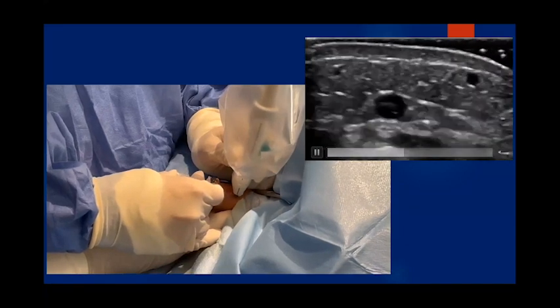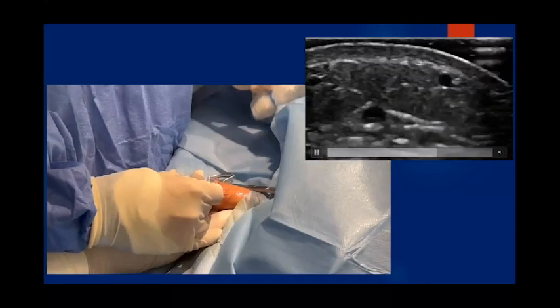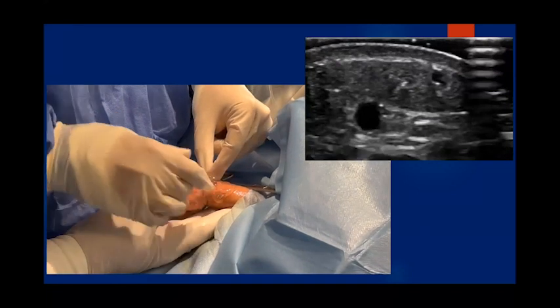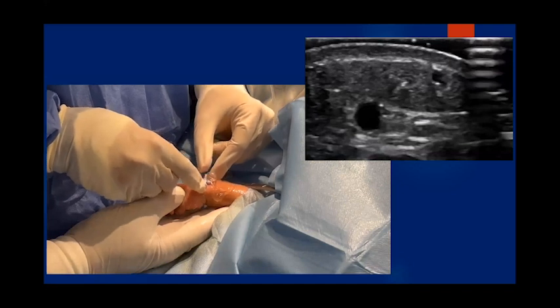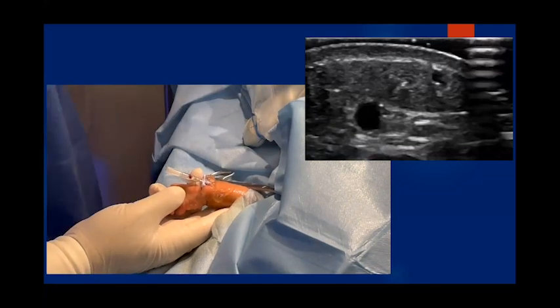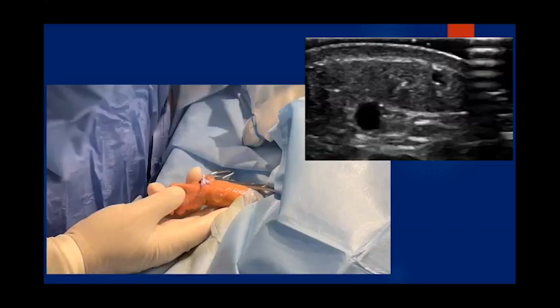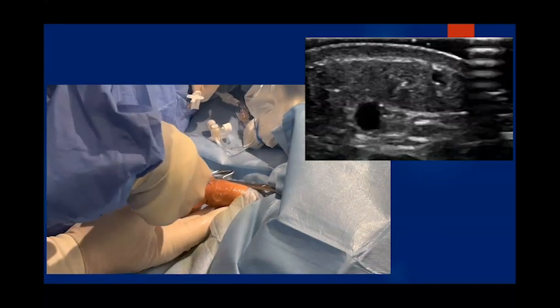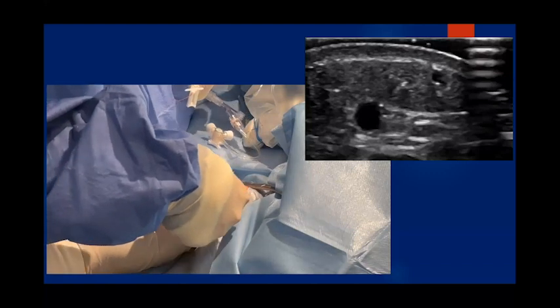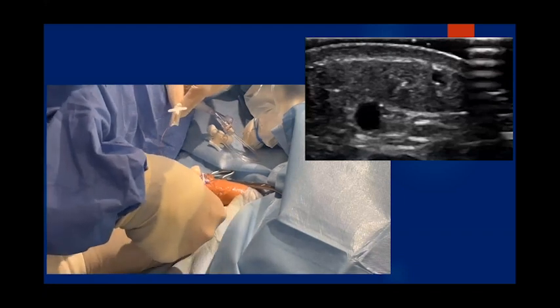And although we see it once inside the vein, it can be deceiving sometimes. In small neonates, if you see it inside, it might actually be just above the vein. So you want to do this procedure several times and make sure that you're inside the vein before removing your catheter. So here you can see that we've done it several times. We walked our needle inside until we have blood back. And then at that time, we insert the PICC line. You can replicate it, but I think this is one of the skills that really needs mentorship.